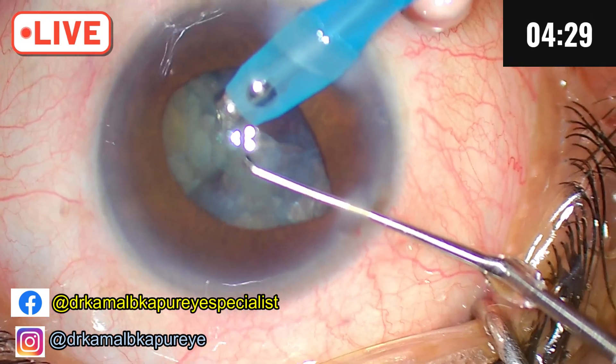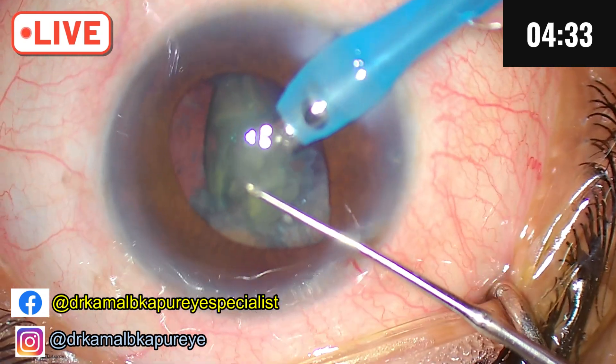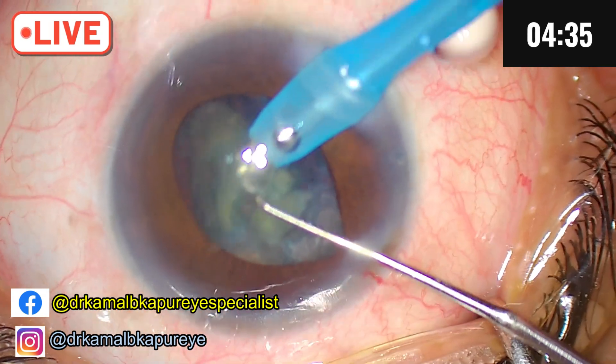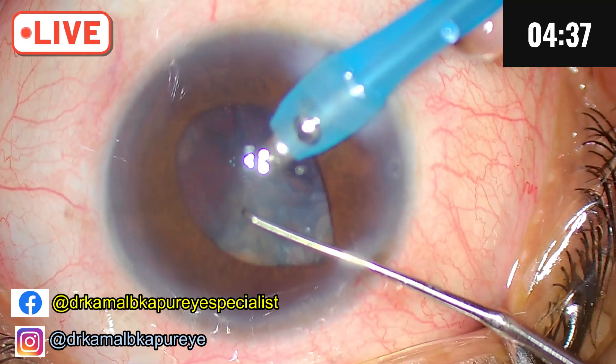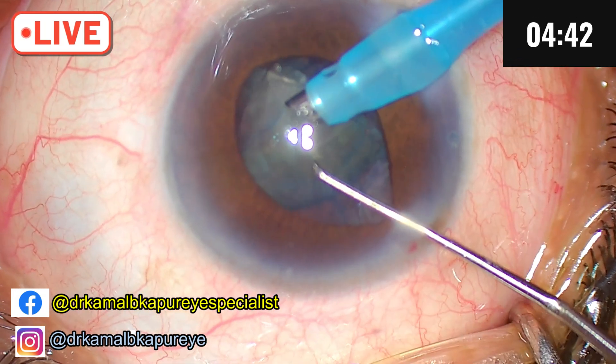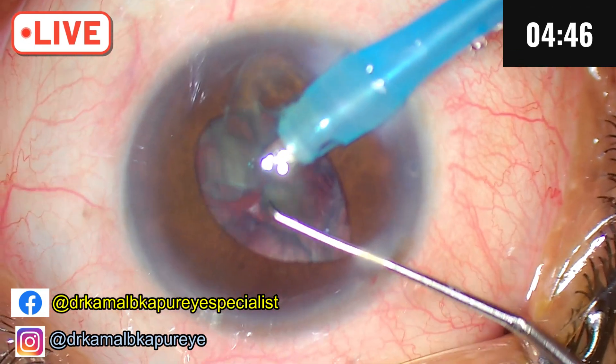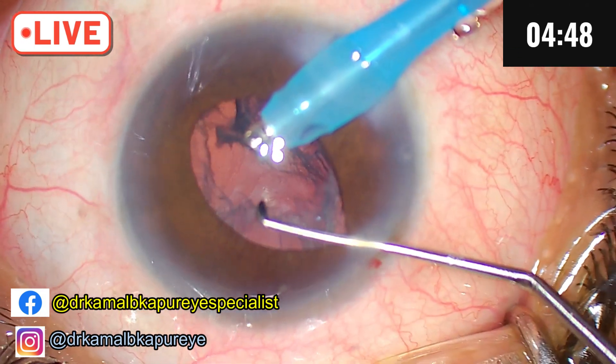Fluid is off, fluid is off, fluid is off. You can hear the sound of the machine. I switch off the fluid on and off in between. Sometimes it's a good idea to have a little leak also in the sleeve because whenever there is an increased pressure, it acts as a valve.